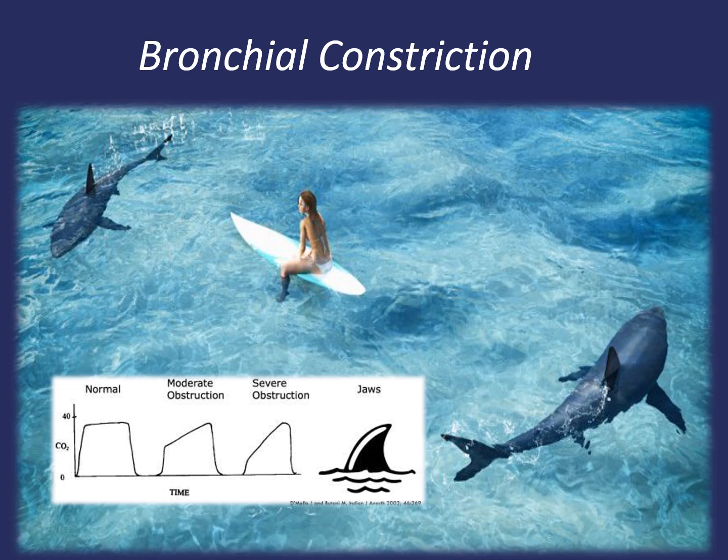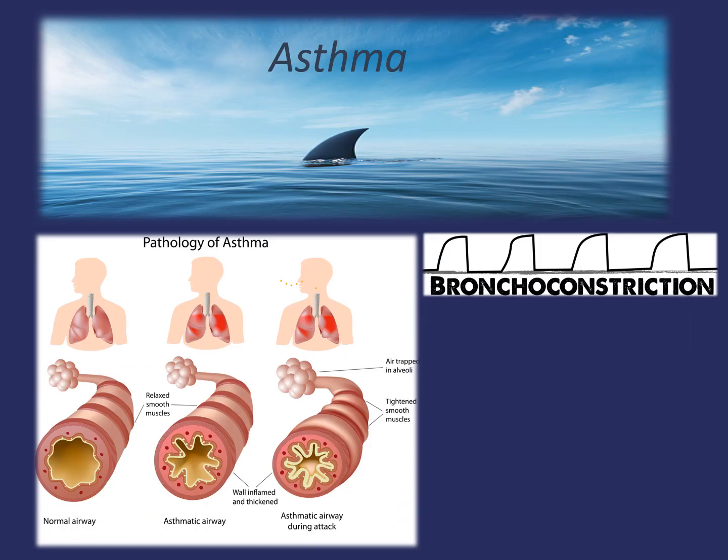This is where we have to combine our patient's clinical presentation and the indications of the capnogram waveform. There may be patients with long-standing obstructive airway disease that will normally or naturally have a slight slope to phase 3 without signs or symptoms of bronchospasm. Mild asthma will often result in lower than normal end-tidal CO2 levels with minimal waveform shape changes as the patient initially hyperventilates to compensate, decreasing end-tidal CO2 values.